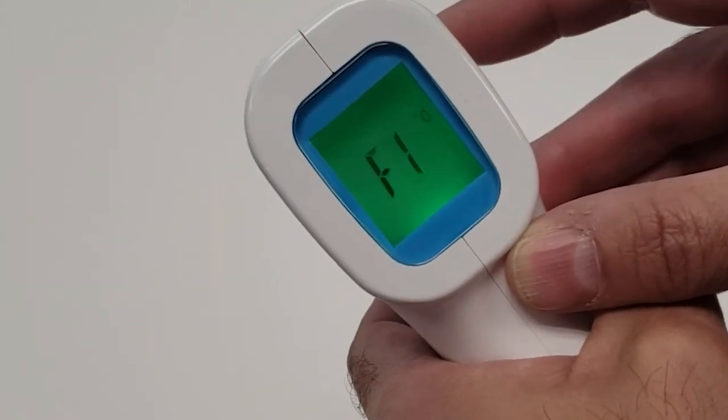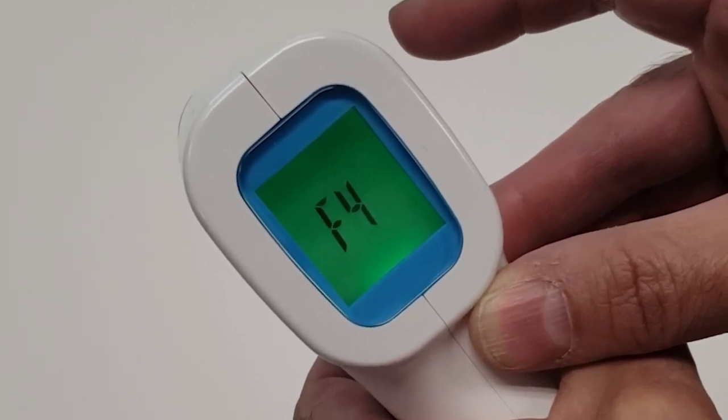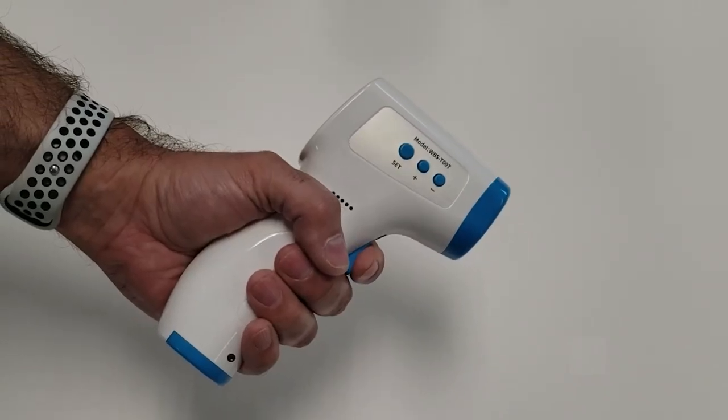Once you choose your preference, press the Set button until the screen goes to F4. The screen will then go dark. Now you are ready to begin a temperature reading. To begin a temperature reading, press the Start button.